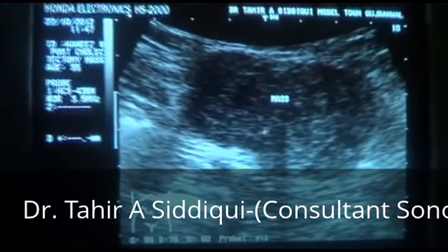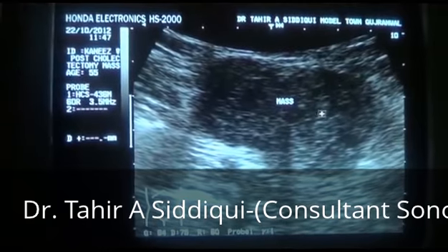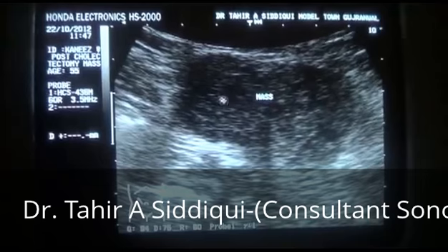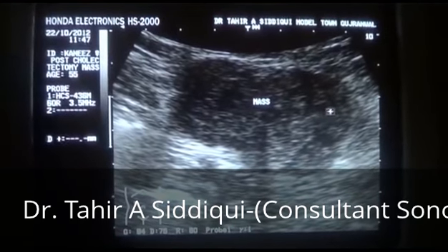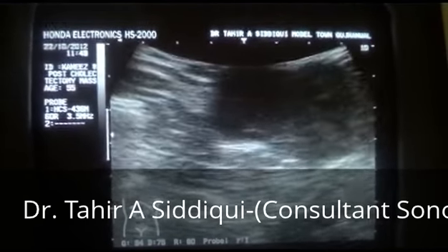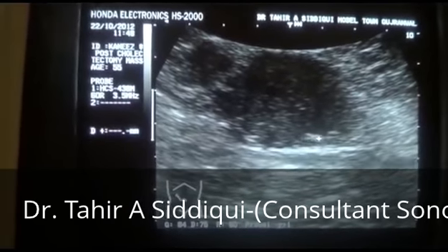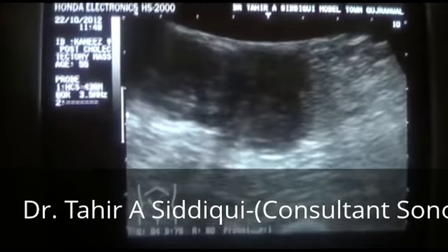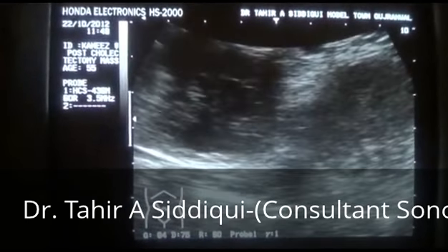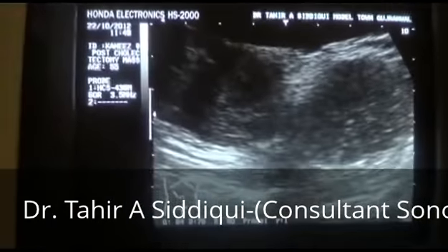Its internal echogenicity is mixed, with a few tiny cystic areas seen within it, and there is also a calcification within it. Now you see these are the two masses together, communicating with each other.